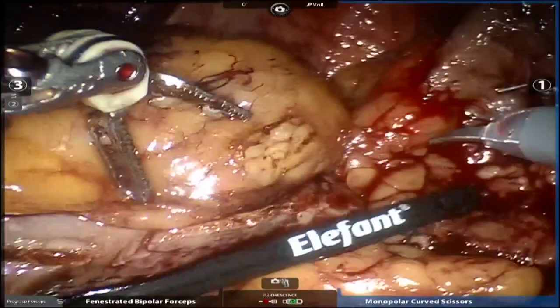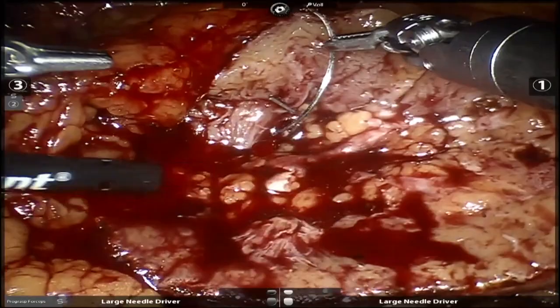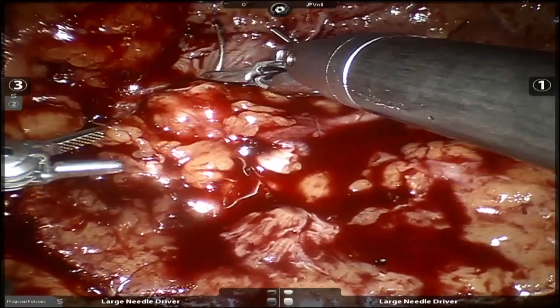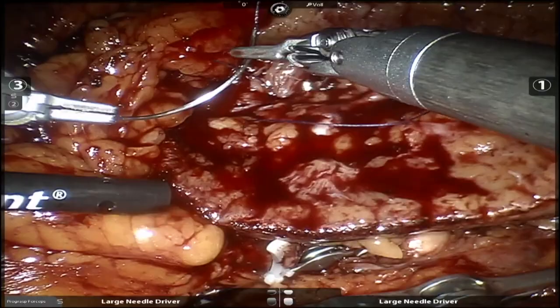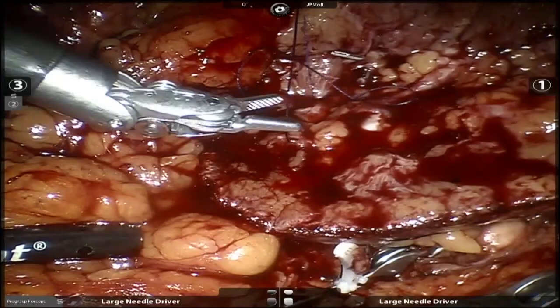Okay, needle drivers. Looks nice. Is this a 4-0? 4-0, yeah. So right here, Brandon, let's look for the large vessels and collecting system. So I'm just going to start on the vessels here. A giant needle today, but that's okay. This is 15, Brando. And this is micro 4-0.